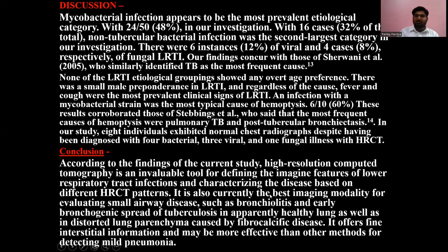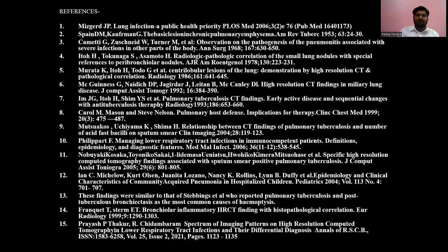It is also currently the best imaging modality for evaluating small airway disease such as bronchiolitis and early bronchogenic spread of tuberculosis in apparently healthy lung, as well as distorted lung parenchyma caused by fibrocalcific disease. It offers fine interstitial information and may be more effective than other methods for detecting mild pneumonia. This is my reference article.